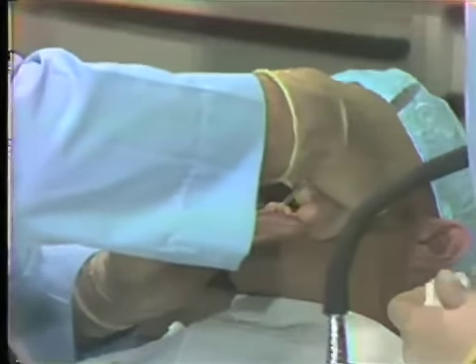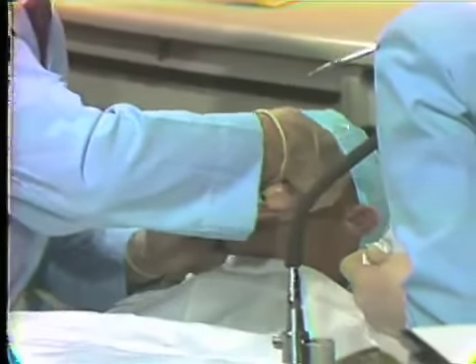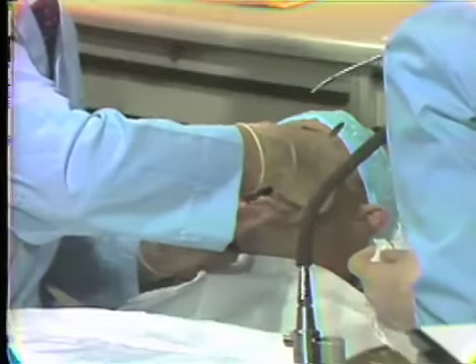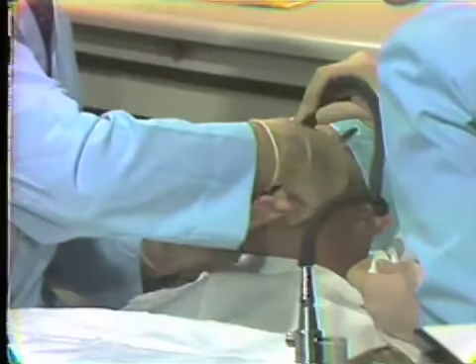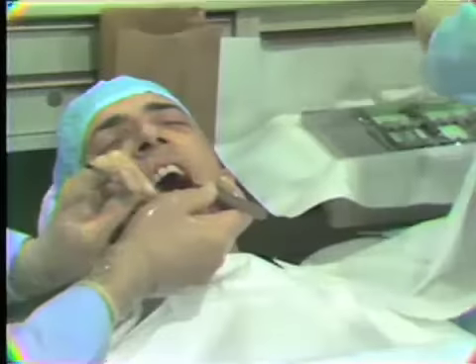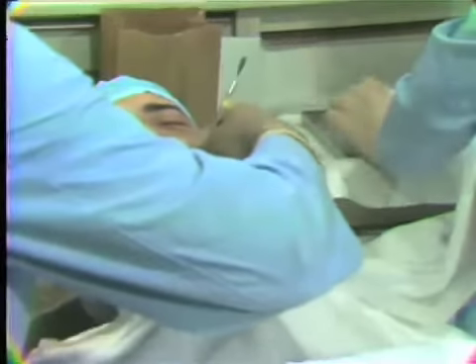And again, periodic removal of the hemorrhage from the labial areas as well as darting in periodically on the lingual areas clears that area for me and does not obstruct my view in trying to make the incision around the lingual aspect of these mandibular anterior teeth. The number 7, please. Wide for me, Mr. A.G.